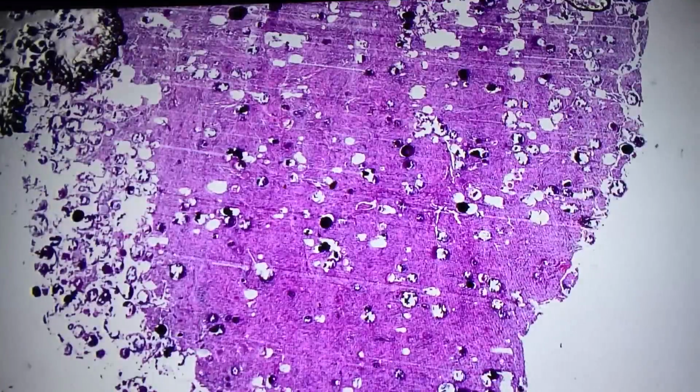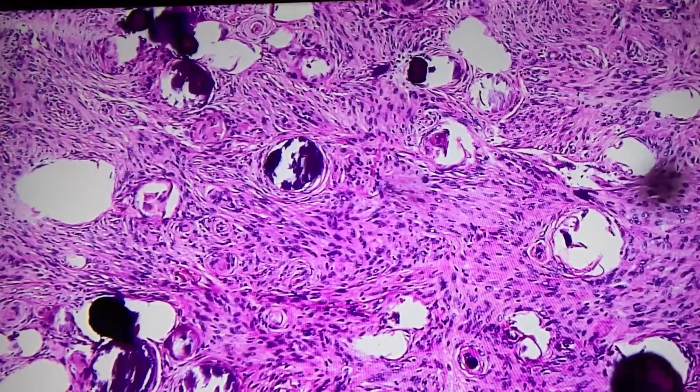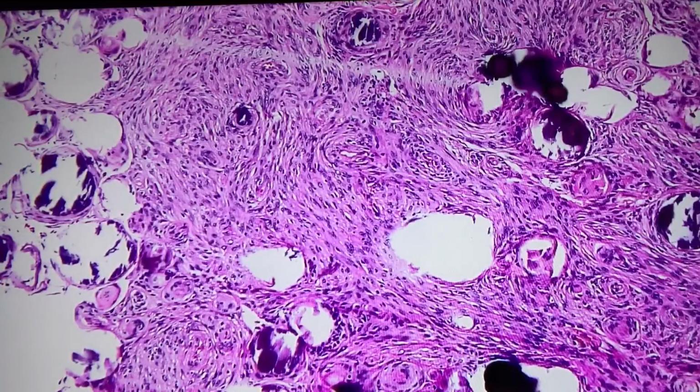All right, guys. Here's one for who's a first year that I haven't picked on yet? Anybody? First year? Did I not pick on any first years yet? I'll take it. You know what? Okay. What is this? Well, I see calcification. Yes. It's kind of spindly. Yes. It's very spindly.